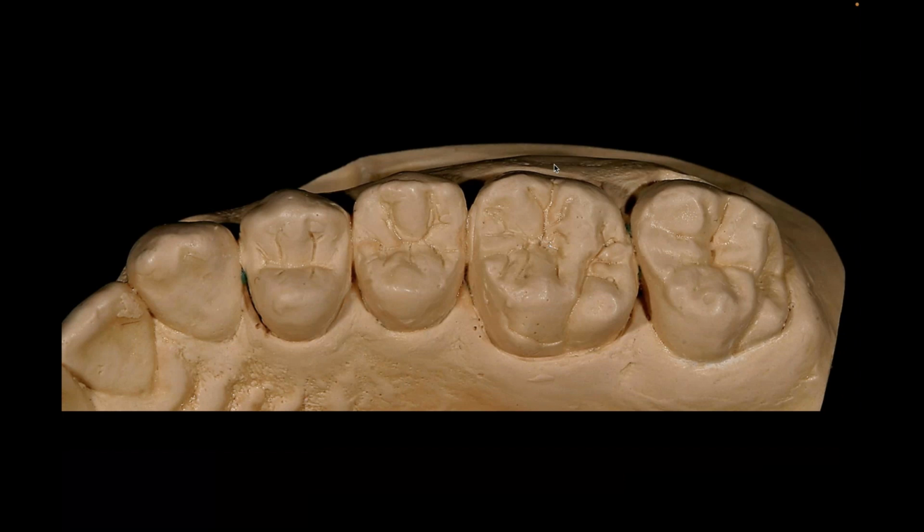Why is that evident in what this picture shows you? Look at where your contacts are. Look at how small those contacts are. And that allows the tooth, from a root position, to actually torque itself and move as it's getting pressure from the lower tooth. So if I make this as a bridge, the teeth aren't going to torque anymore, especially if there are pontics, but I still have to design the functionality of the tooth the same.